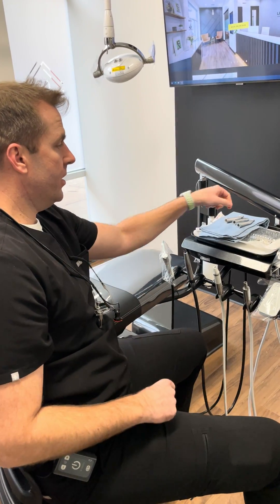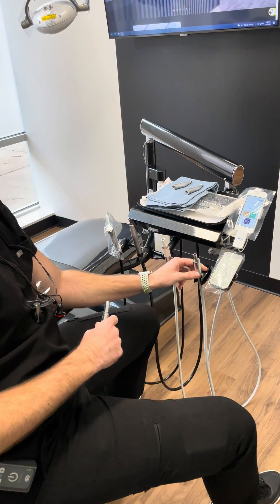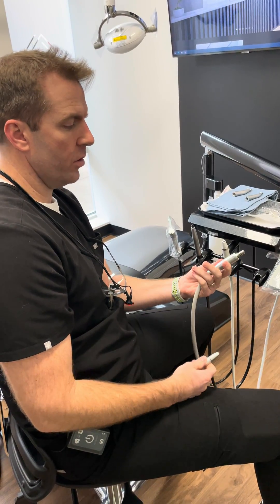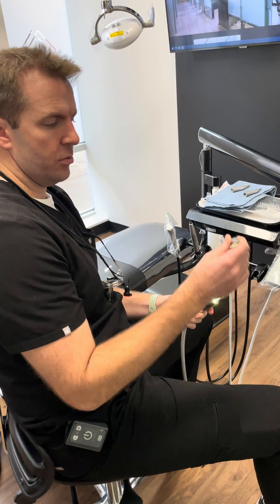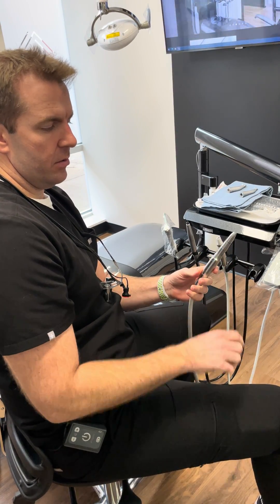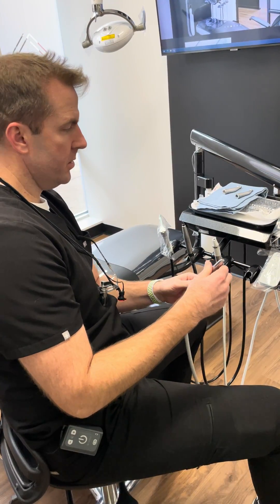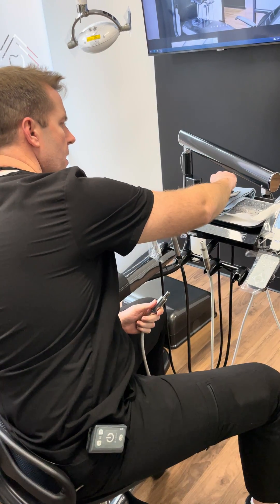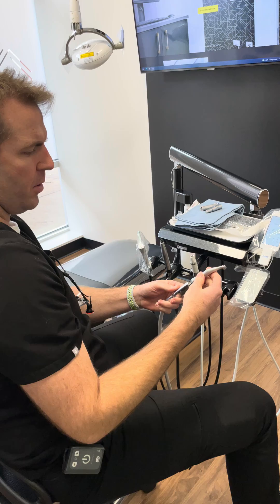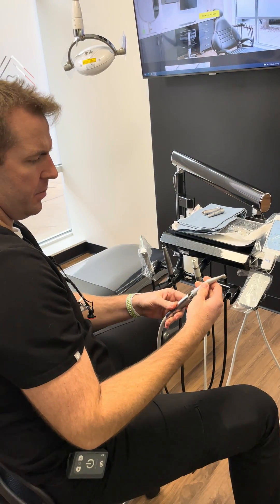And even lab handpieces, straight nose handpieces, and prophy handpieces. It's kind of like an all-in-one motor. So this is one of our straight handpieces. We also have some straight prophy angle handpieces that work really well. It also has an LED fiber optic light that goes through the handpieces.